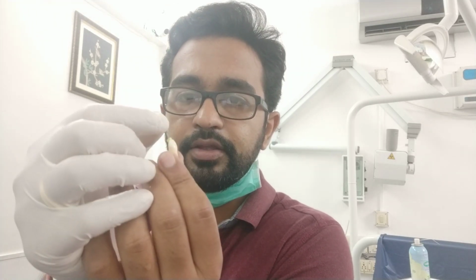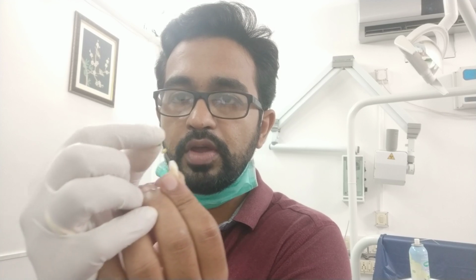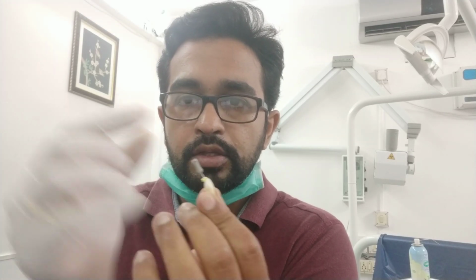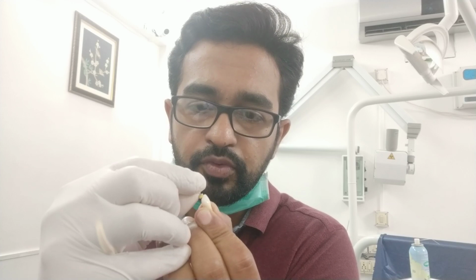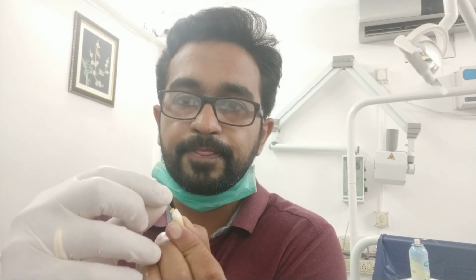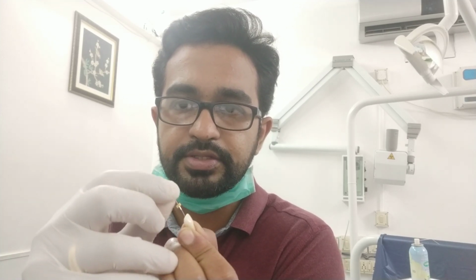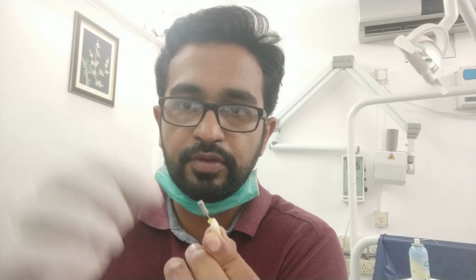So how will you do the filing? You have to just rotate the file a little bit, and then you have to do to and fro motion. While doing the to and fro motion, you have to make sure you do a circumferential filing, means you should file in all the directions. Filing means ghisna basically. So you push the file towards the buccal side of the tooth and do 7 to 8 times the filing to and fro. Then again on the mesial side, lingual side, and also on the distal side.